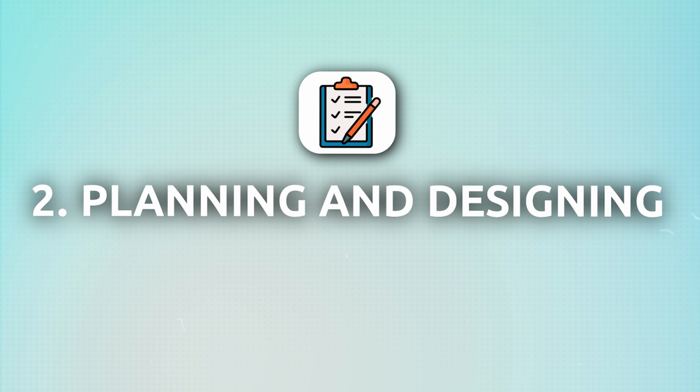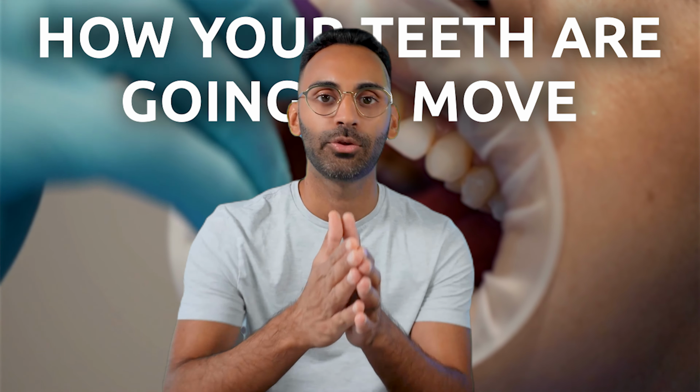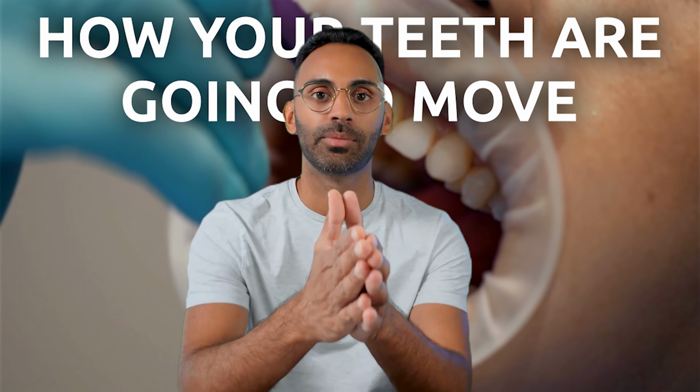So would you trust your dentist if they didn't have a plan in place to improve your oral health? This is where the second piece of the puzzle comes in, which is planning and designing. Your dentist is going to create the tooth movement roadmap, which is going to determine exactly how your teeth are going to move to get into the final position that is so desired. Once they have this, they're going to relay to the lab that they use how to design these custom aligners to fit your teeth. This is a very precise art. There is AI technology involved in this process, and it's super interesting. There is a human element involved where people are cutting and trimming trays, but a lot of different companies are innovating and coming up with different ways to optimize this stuff.